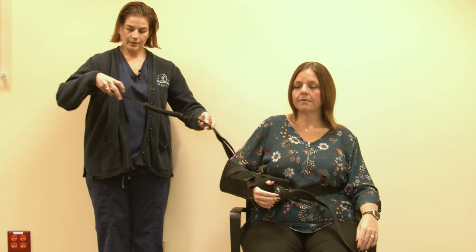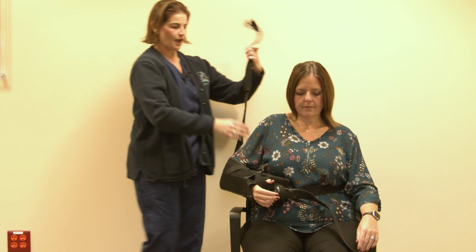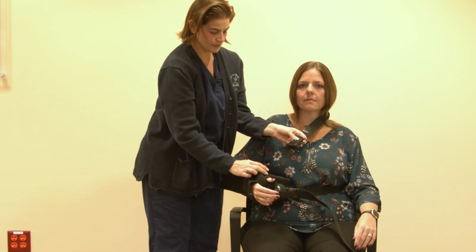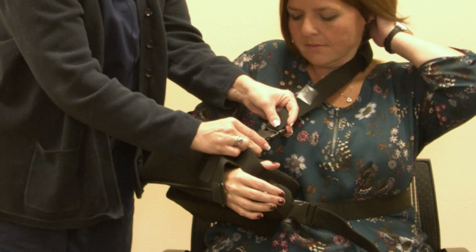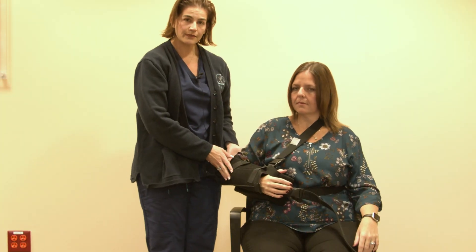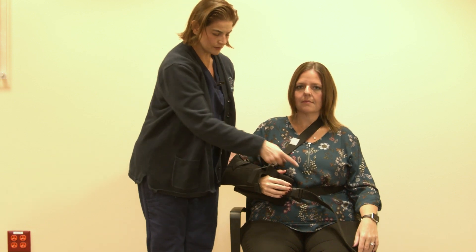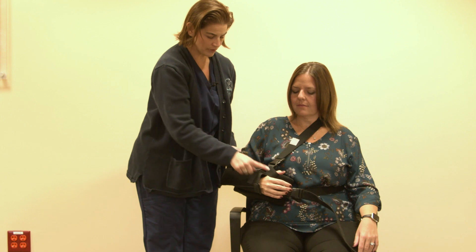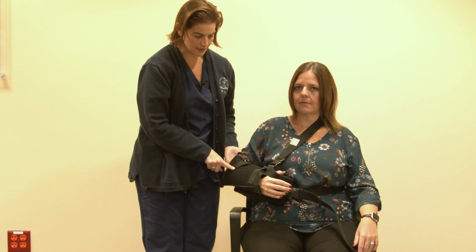There's a second strap. This is going to go around your opposite shoulder and buckle into the front. So now Brittany is safely in the sling, buckled in the front here and here. Her thumb is secure in the loop and she's strapped across the front.